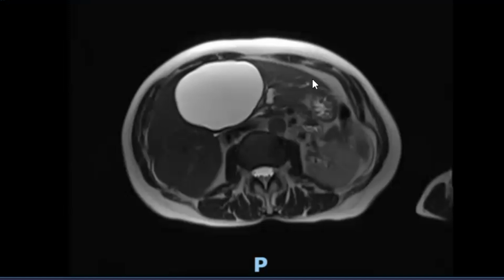In this case, I do a puncture and I evacuate the cyst in order to see if there is a relation between the cyst and the symptom. It seems very easy to do. Of course, it is not a treatment, but it is a diagnostic.